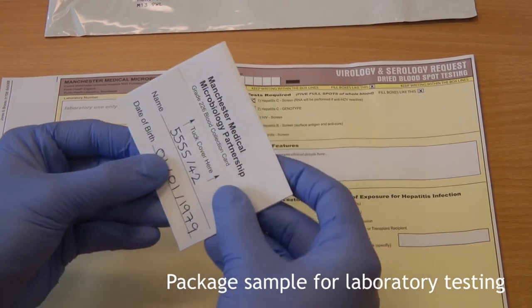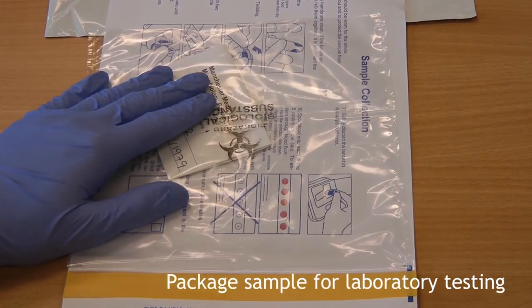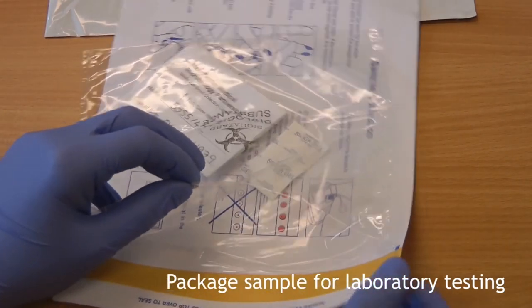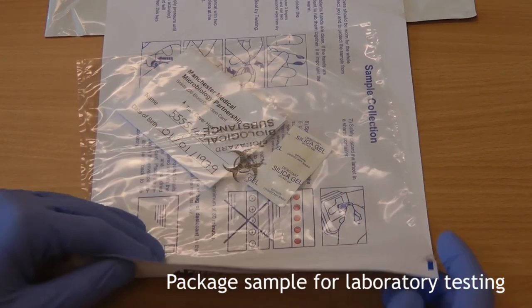After the card has been drying for 30 minutes, close it and put it and the silica gel packet into the clear plastic bag attached to the request form. Please ensure the silica gel pack is included as this helps preserve the sample during transport. Once you have checked the correct details are on the request form and the card, remove the brown tape and seal the card into the plastic bag.